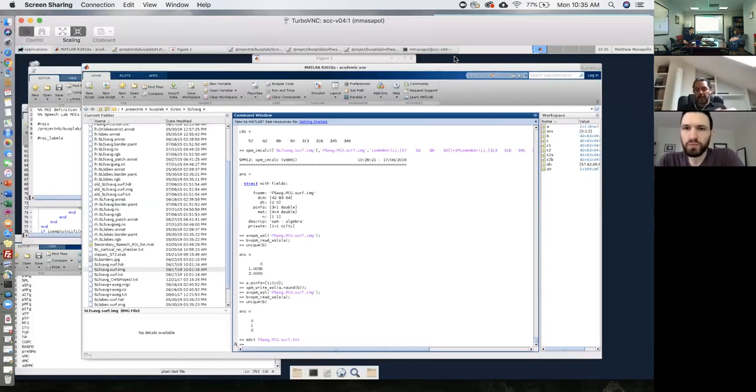Then the effect sizes are going to show you the regressor for the first column and the second column, which are in this case the average speech minus baseline over the contrast you're looking at for the first group and for the second group. So it always applies that in general, it's going to show you a list of all of the regressors that are actually included in your contrast. Whatever complex contrast you specify across multiple elements in your design matrix, it is going to show you the original regressors before they were combined into that contrast. And it tries to label it in a way that makes sense, so it's easy to interpret.